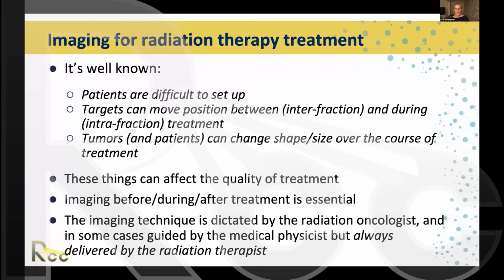Usually the imaging technique that you use during treatment is dictated by your radiation oncologist, and in some cases it's through guidance by a medical physicist, but the imaging used on our patients is always delivered by the radiation therapist. So that's why it's really important that you all understand how the imaging works and a little bit of the theory behind the imaging processes.